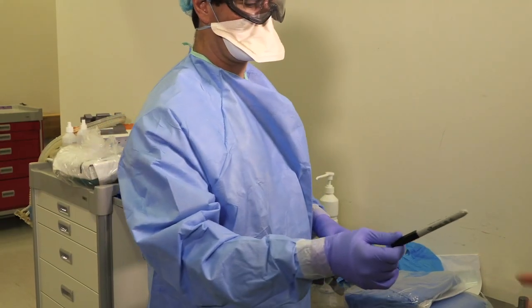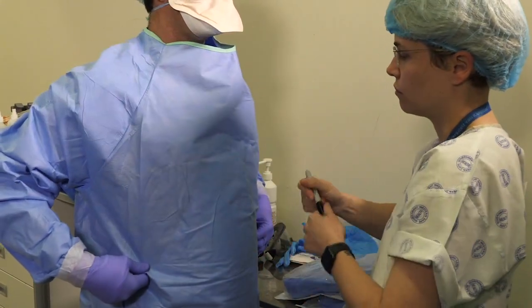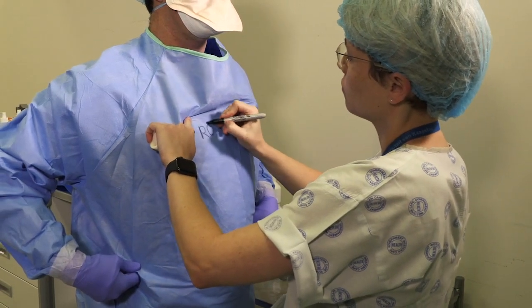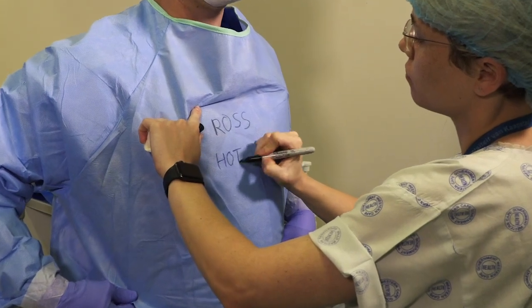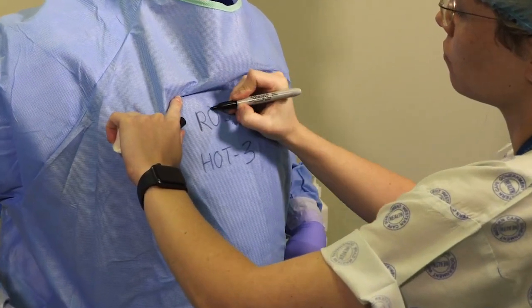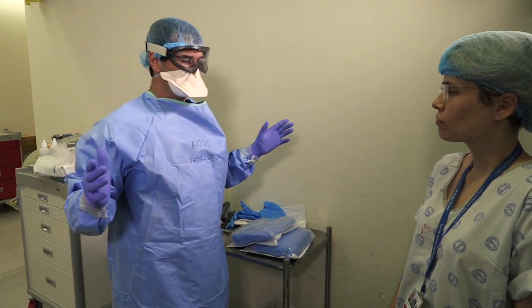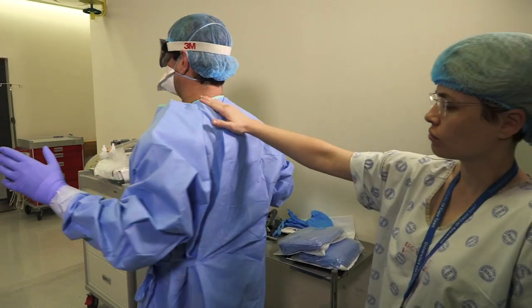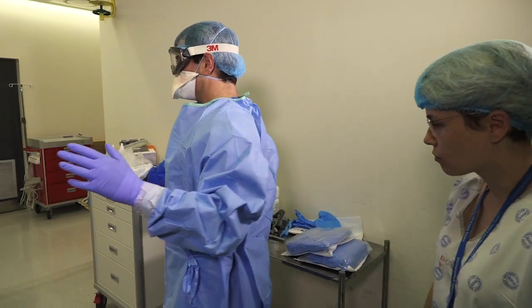Lauren, please write Ross's name and his role on the front of his chest. Lauren, will you please check Ross as he rotates through 360 degrees to make sure that he's properly donned. There should be no undergarments visible. The gown should be completely closed at the back — no gaps.